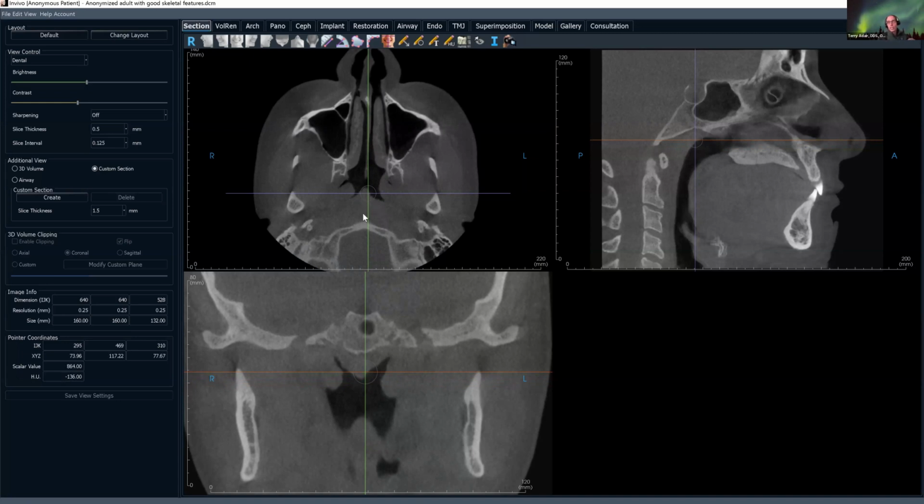So if the adenoids are enlarged, these structures sort of get pushed out of the way, and you may not see very good detail of these structures right here. These are the adenoids right in here. So this is the upper aspect of the nasopharynx. The nasopharynx is from the height to about the level of the hard palate. So the nasopharynx is not a very big anatomic area. Your oropharynx extends from the hard palate to the tip of the epiglottis. So it's a much bigger part of the airway.